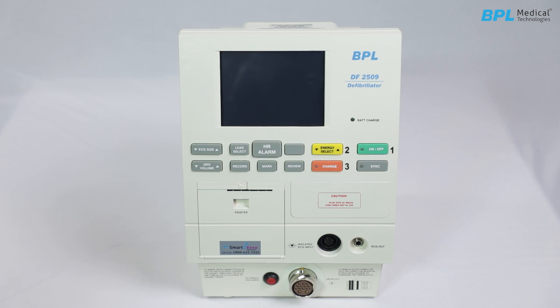HR Alarm: activates an alarm if the patient's heart rate exceeds a certain threshold. Lead Select: chooses the input ECG source from lead 1, 2, 3, or the paddle; the selected ECG source is displayed on the screen. ECG Size key: allows you to increase or decrease the ECG height on the display.